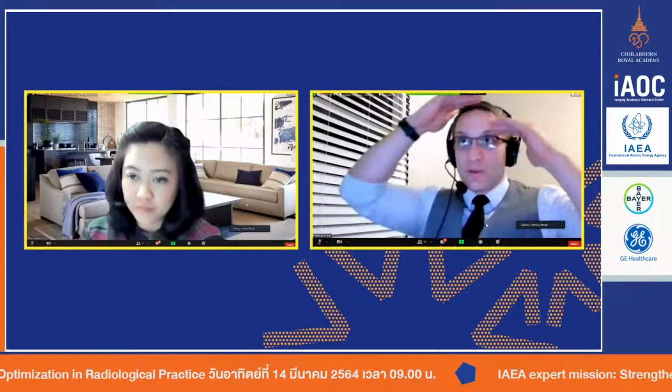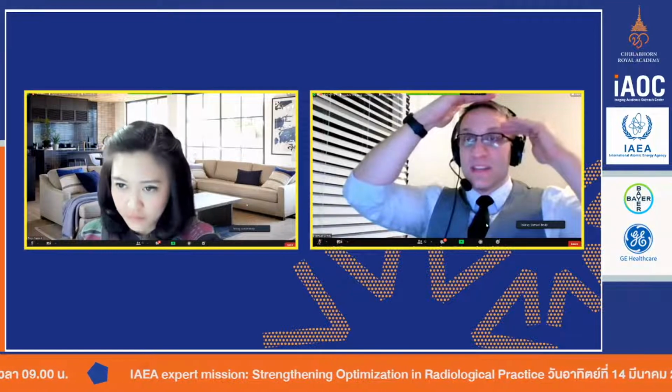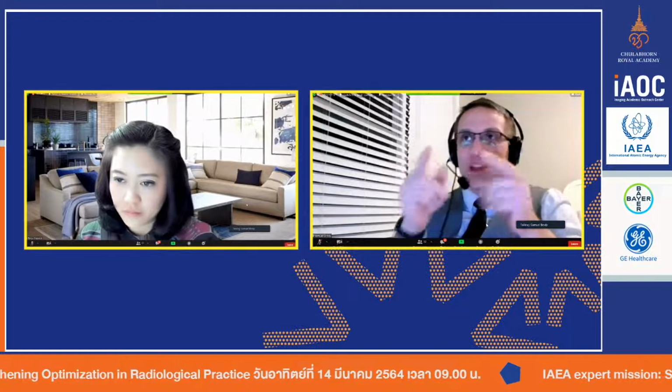We always set it up so that, for example, if I'm doing a 160 millimeter slice here, I'm going to acquire the data at 320 detector elements, each at 0.5 millimeters. And when I reconstruct that 0.5 millimeter data and you as a radiologist look at it, it's going to look horrible.